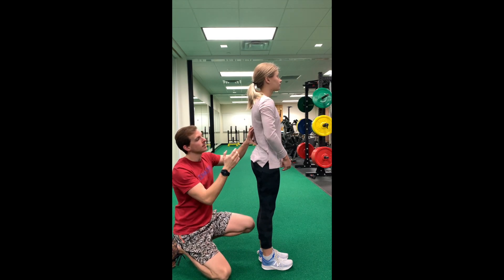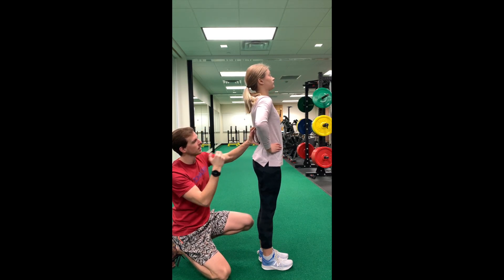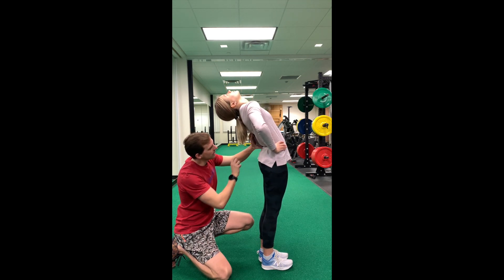Hit start again, then have the patient extend backwards as far as they can, and stop.